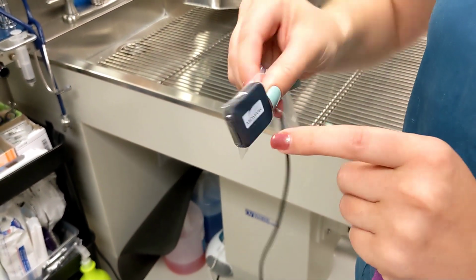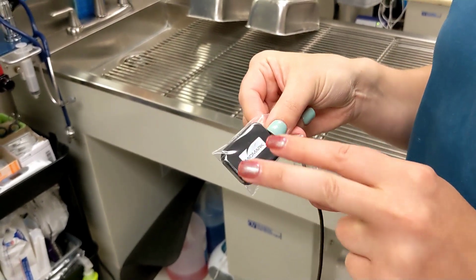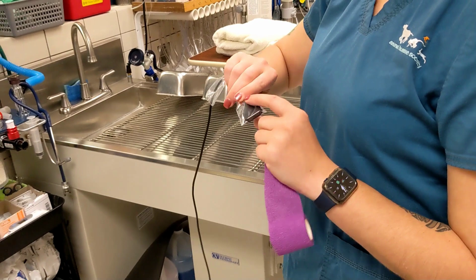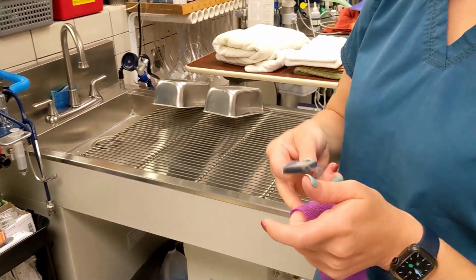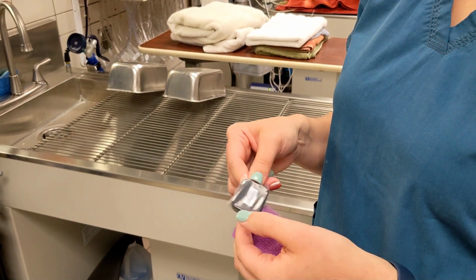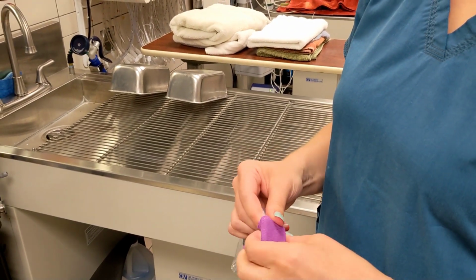If you use vet wrap, it is important to keep the flat side of the sensor as flat as possible and free from folds and wrinkles caused by the vet wrap. The flat side of the sensor is the side that takes the image. If there are folds or wrinkles within the vet wrap, you may get false images.